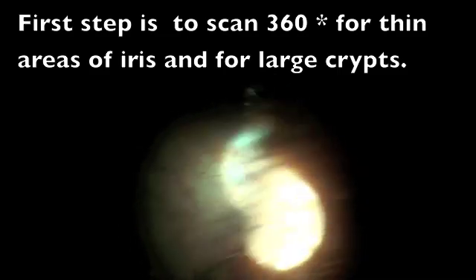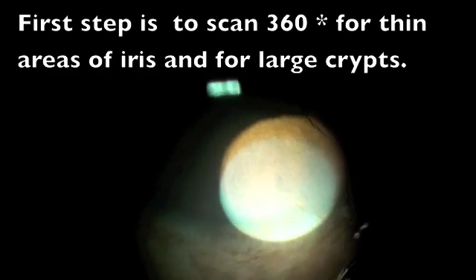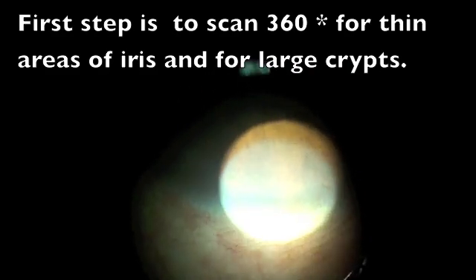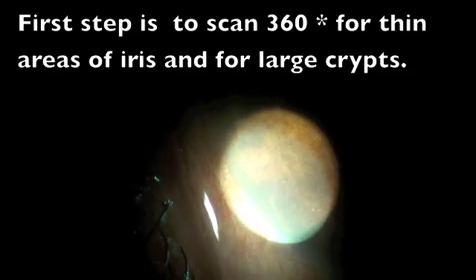We are seeing the iris — there are one or two small crypts, but none large enough to interest me. So we go back to the original place where the iris stroma is slightly thinner than normal.